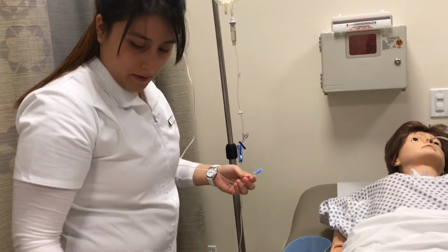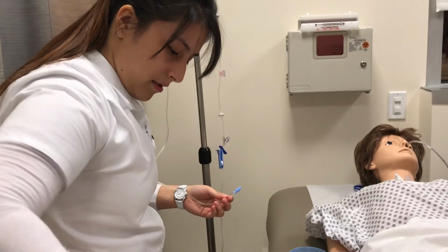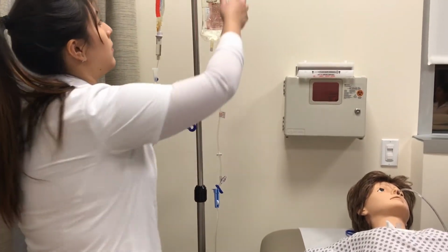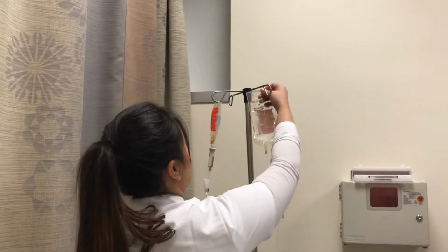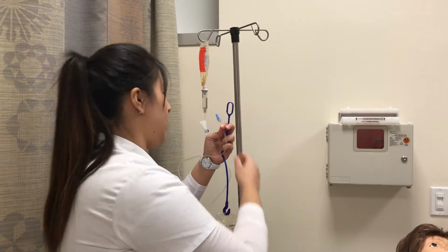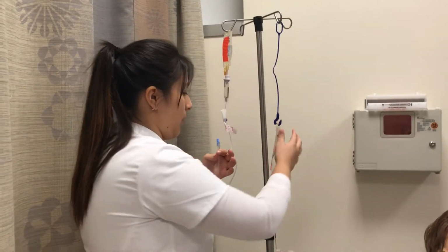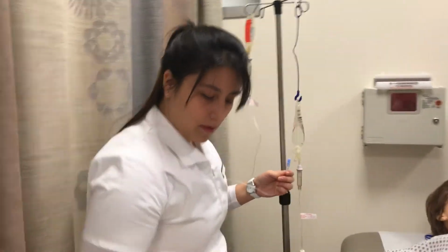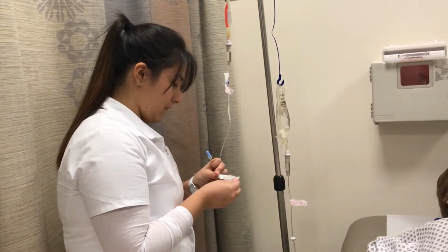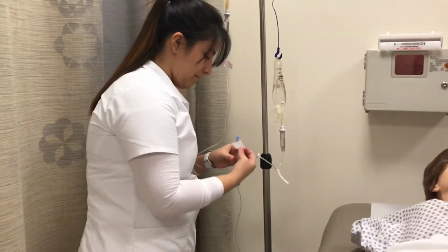Okay, so now I will be setting up my IV bag. Lowering my primary. Okay. And now I have to clean the primary tubing for 15 seconds.